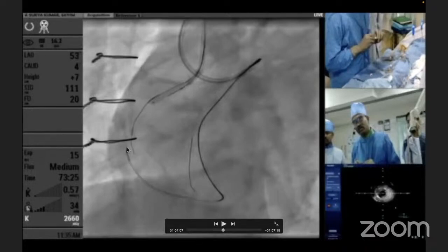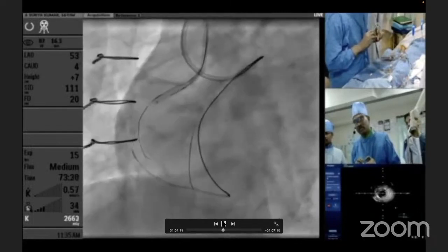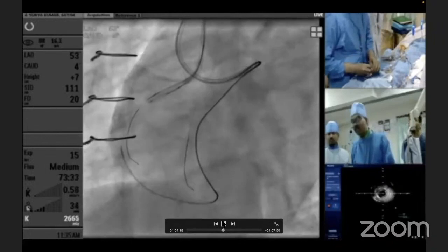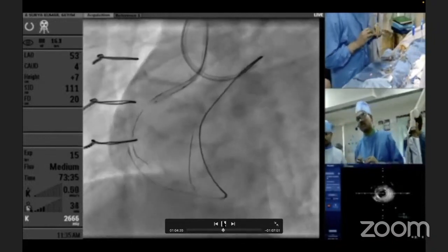Now you can see the retrograde microcatheter, and you can see this is the antegrade wire. Anchor. And we see very nice teaching. You see there is JR. So to increase support, he's trapping the microcatheter with a balloon to increase support for his antegrade wiring. So this is anchor, and I took an antegrade Gladius, and I'm advancing. Now you can clearly see the catheter, the wires, and the distance between the wires.